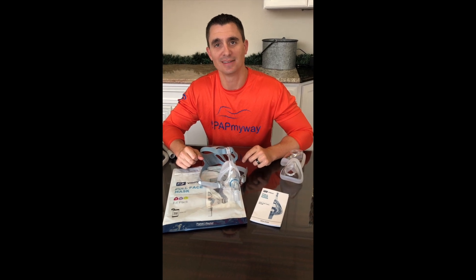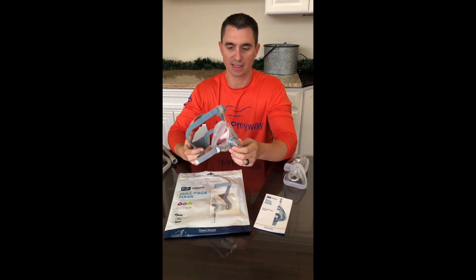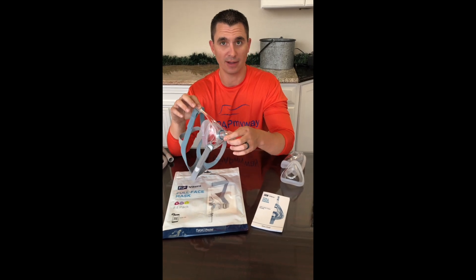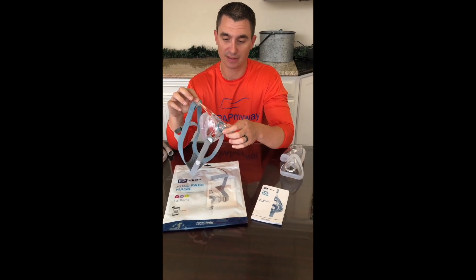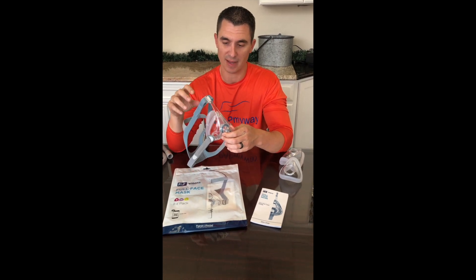Hey, I'm Clay with CPAP My Way and CPAPmyway.com. I want to introduce you today to the Vitera Full Face Mask. This is the latest and greatest from Fisher & Paykel, and I'm going to point out right off the bat that it is very similar to the design of the Fisher & Paykel Simplus, which is the predecessor of this mask.